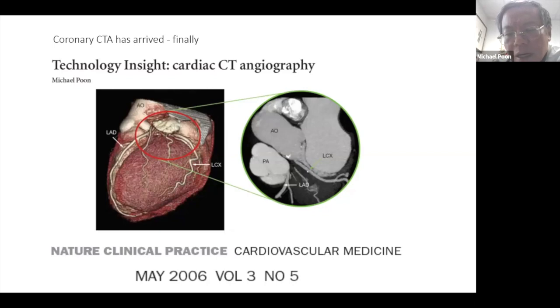In specific, the problem with the blood vessel to the heart. A heart attack is basically a blockage inside this tiny vessel, blocking the blood flow, and your heart is not getting enough blood, and it starts to give you pain. So you don't want to wait until you have symptoms to start doing something about it. The CAT scan is now being used to detect this type of plaque buildup early on, so that the doctor can work with the patient and help the patient start to change their lifestyle, and also maybe start taking some medication to keep the plaque from getting worse and worse.